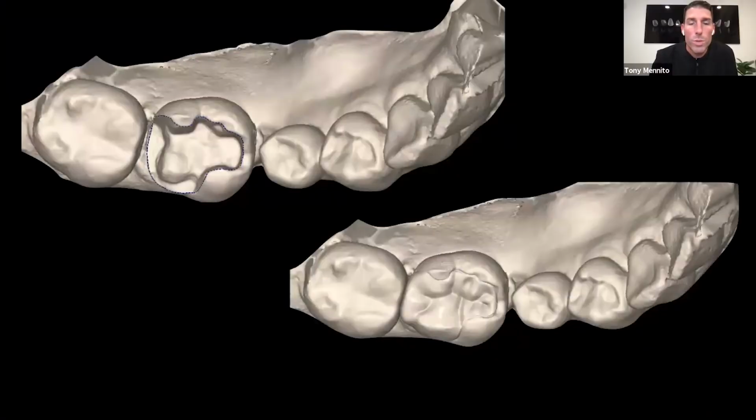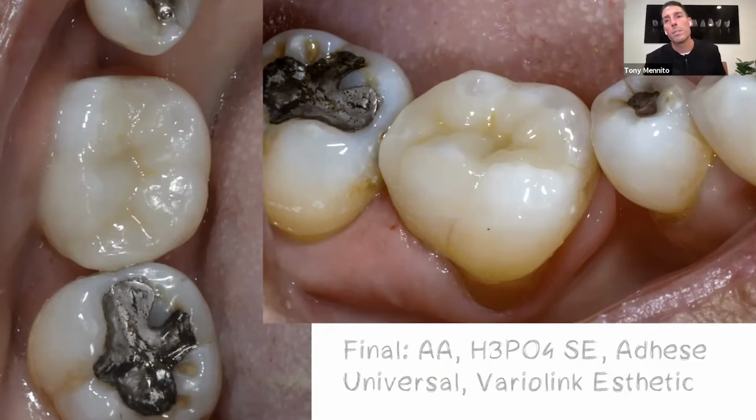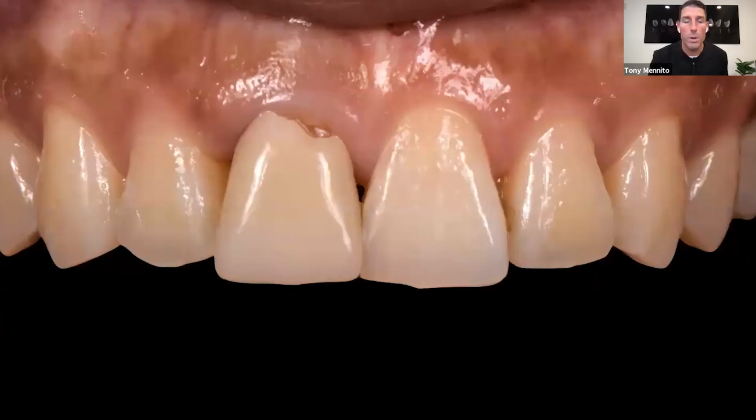and through that, scanned it with my intraoral scanner, threw it in the design software, designed an onlay, and in under 2 hours, sent the patient out with a really pretty restoration. This is a high translucency emax restoration. You can see how well it blends in to the adjacent tooth structure with just a little bit of staining and glazing. I don't spend 10 minutes staining and glazing. I spend 2 minutes staining and glazing. I just like a little bit of that to make it look like it belongs in the mouth.